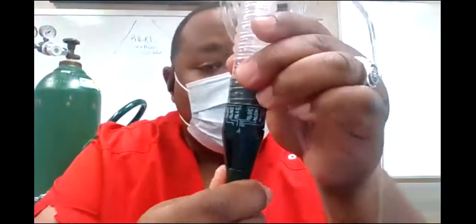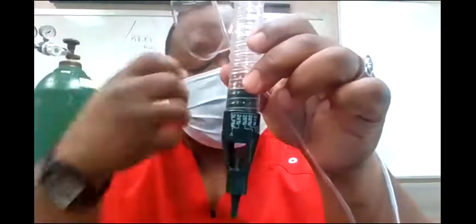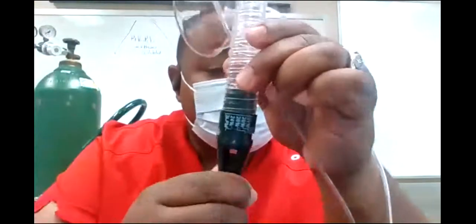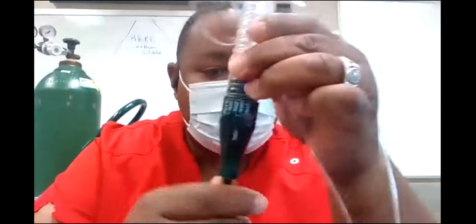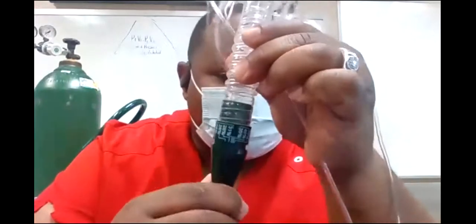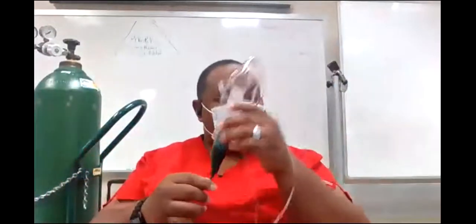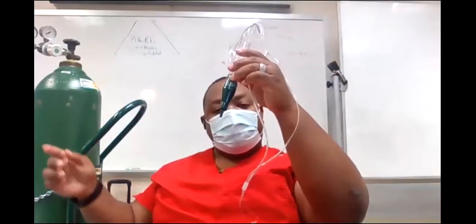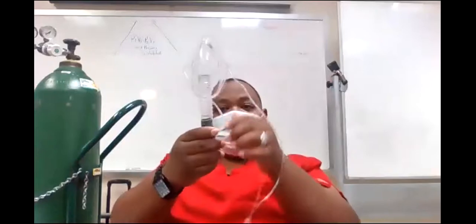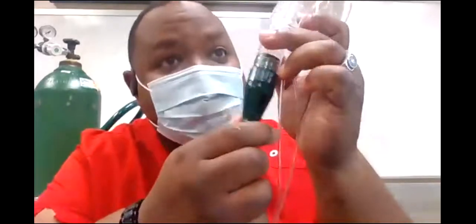So as I open the windows, that's what I basically want you to understand: the more open the window is, just like the window in your car, the lower the FiO2 or the lower the smell is going to be, okay? If I completely shut the windows, then you're stuck with pure smell, okay? And so that's what's happening with the Venturi principle, air entrainment. So as that 100% oxygen goes from your cylinder to here, that's 100% oxygen. But when it gets here, it starts to pull in outside air. And by the time it gets to the patient, it is bled down to the FiO2 that you specified, okay?